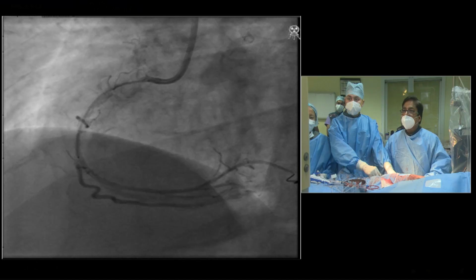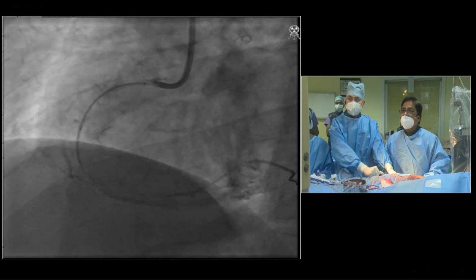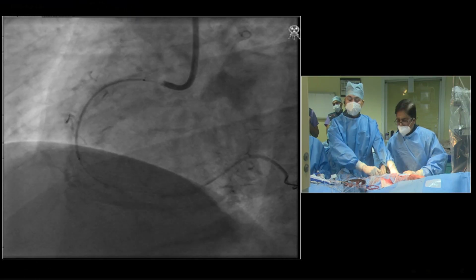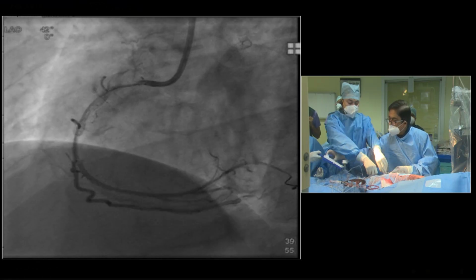A little more forward, a little more forward, that's what I also think. Because the marker is actually inside. I think this is fine. Very good. It is okay. I am beyond the bifurcation, na? Yeah, correct. You are okay.